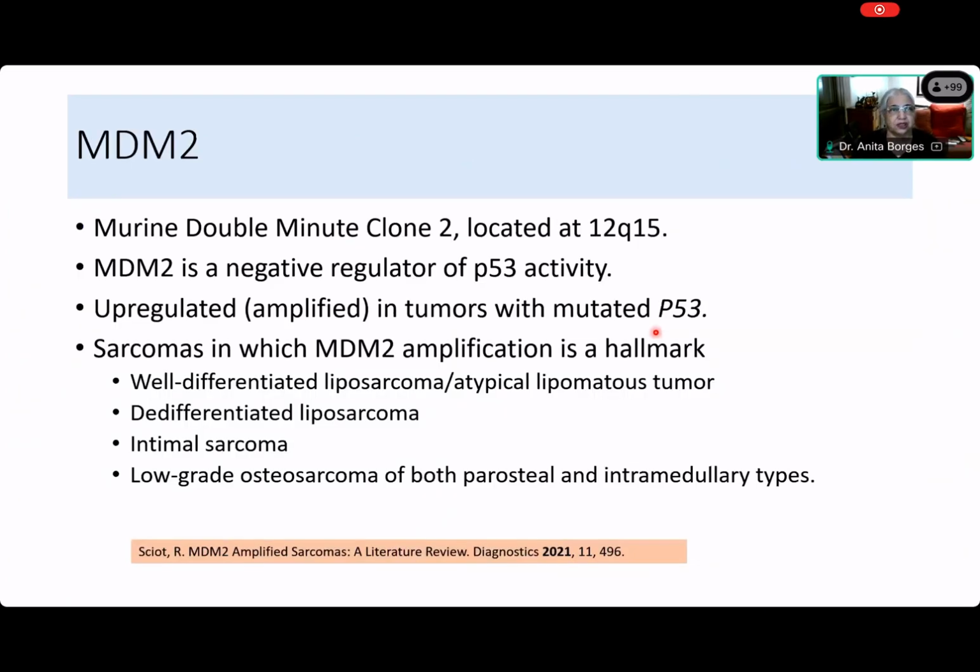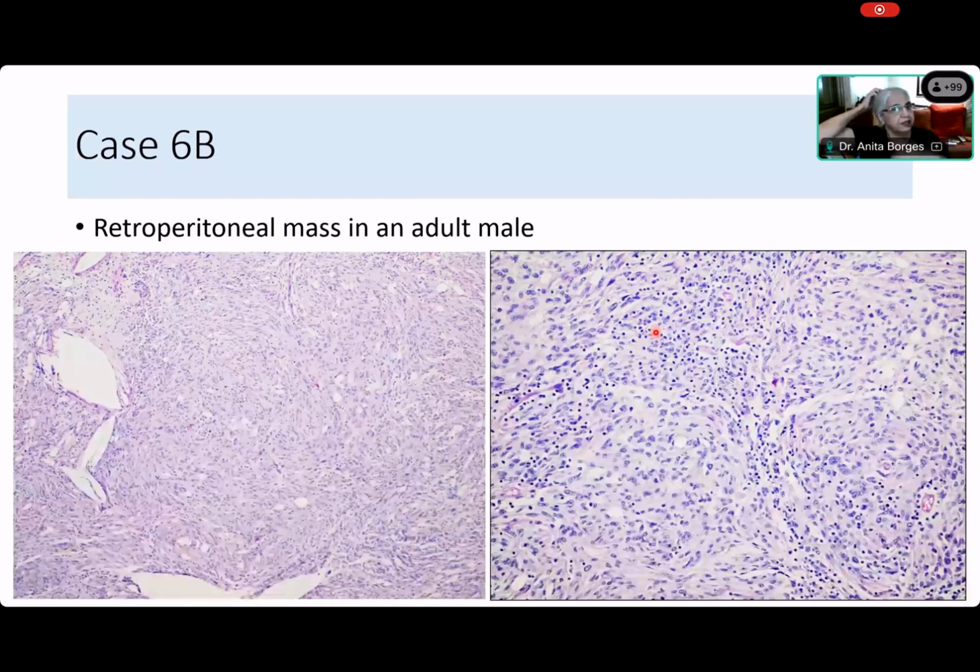So the diagnosis is a dedifferentiated liposarcoma. All right. Now you can find out about MDM2 if you want. And this is the last case. Again, it's a retroperitoneal mass in the adult, and you can see, look at it, it's whirling.